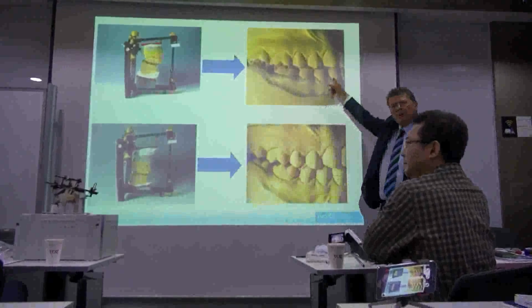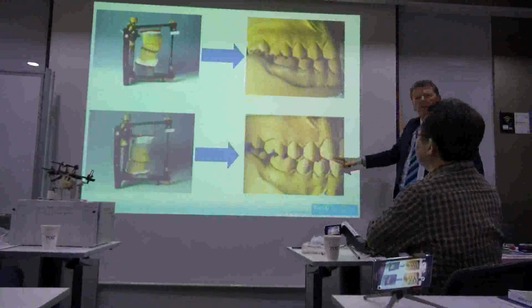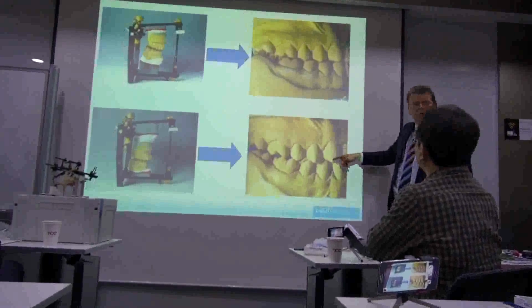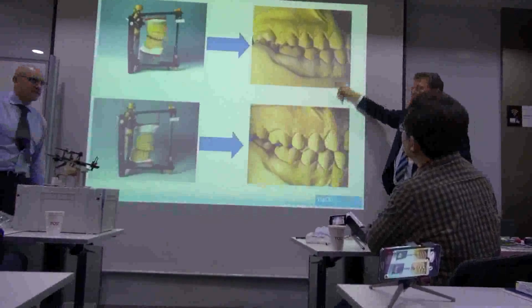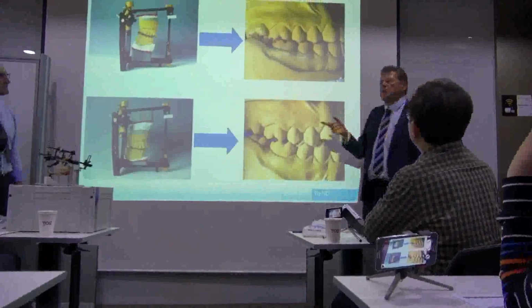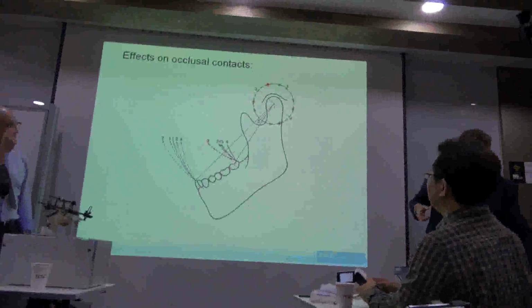Is it the same patient? Can you see here and compare to here? You see the difference? So it's a totally different contact situation. Can you see this? It's the same patient, it's the same cast. It's just a different position, and this is the rotation. Okay? And therefore you should consider this picture, and you should consider this.